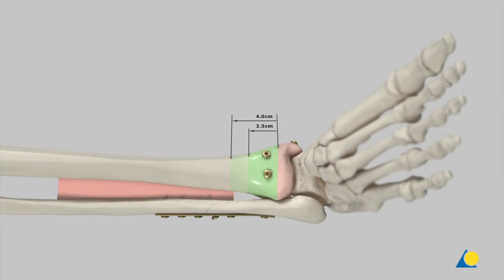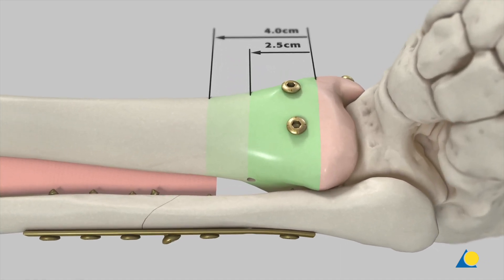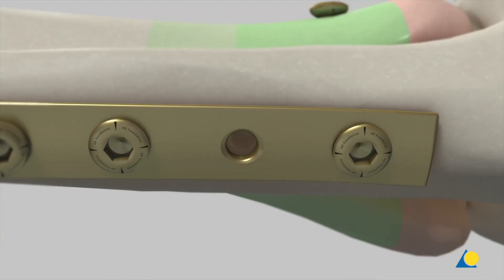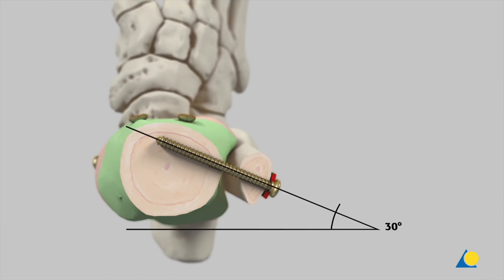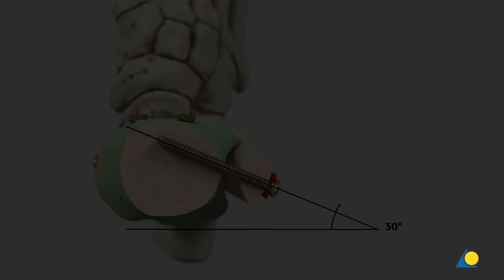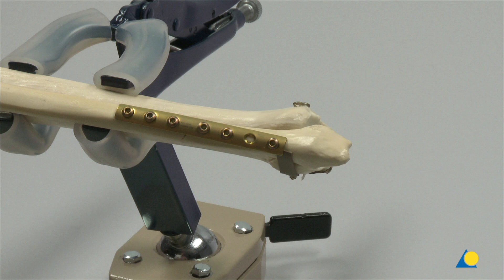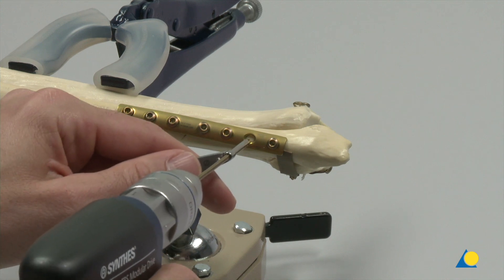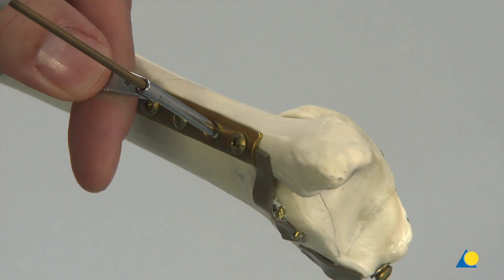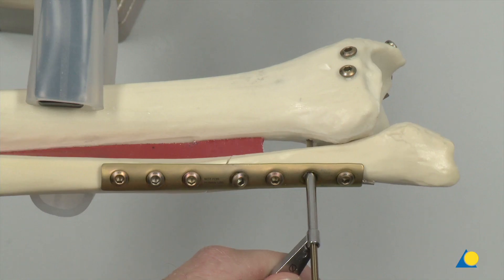The screw should be inserted 2.5 to 4 cm above the anterior syndesmosis. The screw must be inserted at a 30-degree angle from the dorsal direction and parallel to the tibial plafond. Ensure that the syndesmosis has been reduced properly; a K wire or pointed reduction clamps can be used for this. Using the 2.5 mm drill bit and the appropriate drill sleeve, the three cortices are drilled at a 30-degree anterior angle and parallel to the tibial plafond.